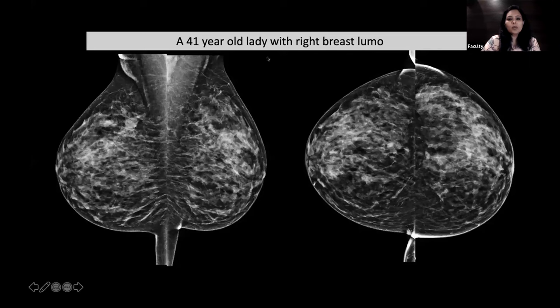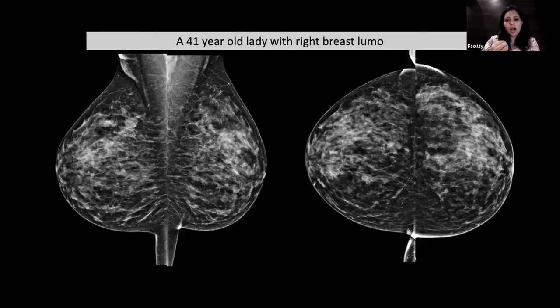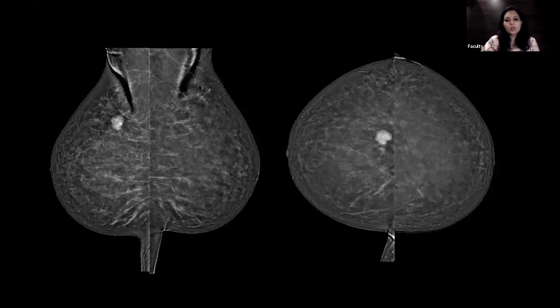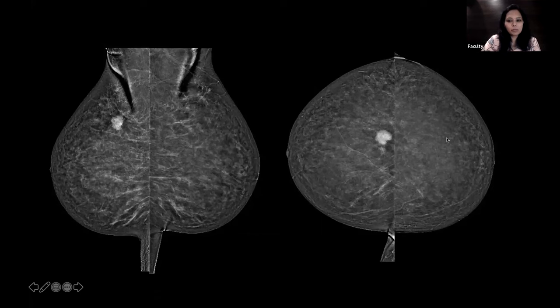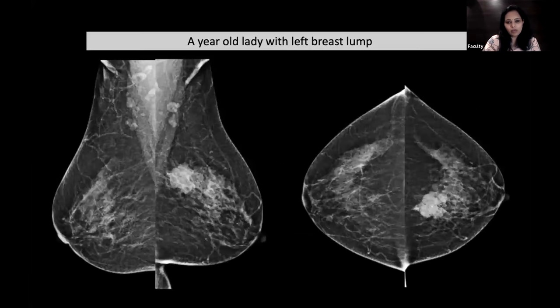A 41-year-old presented with a palpable right breast lump. With a dense breast in a young woman, it is important to determine if the cancer is unifocal or multifocal. Contrast clearly showed this was a unifocal invasive malignancy; the extent was well-defined with no associated non-mass enhancement, and importantly the contralateral breast was normal. This served as a one-stop solution for local staging; ultrasound was additionally used to stage the axilla.